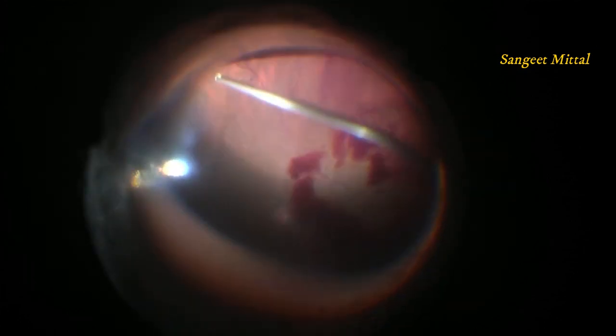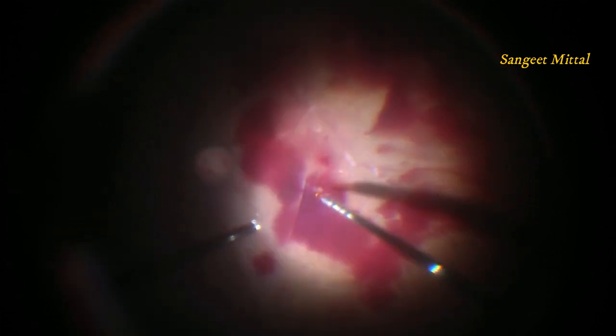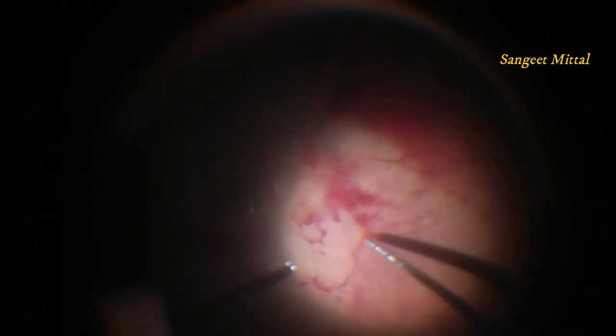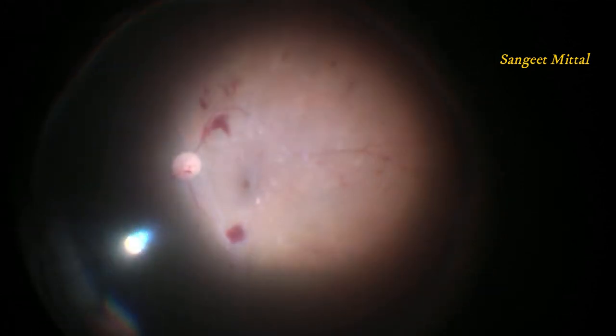A second layer of vitreous is again separated from the retina. This layer is due to schisis of vitreous. Complete shaving of vitreous is done to the vitreous base. Proportional reflux is used to disperse and remove the pre-retinal blood. This completes the vitrectomy, and the only thing that remains is the streak of preretinal blood in the periphery.